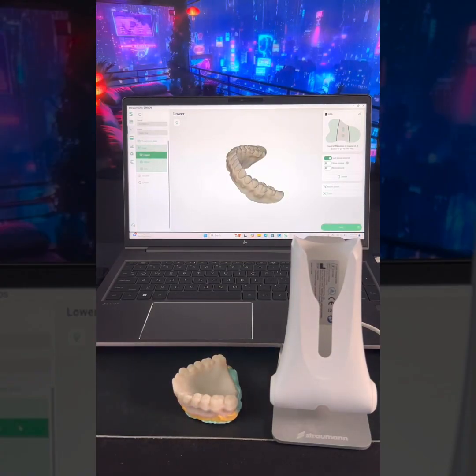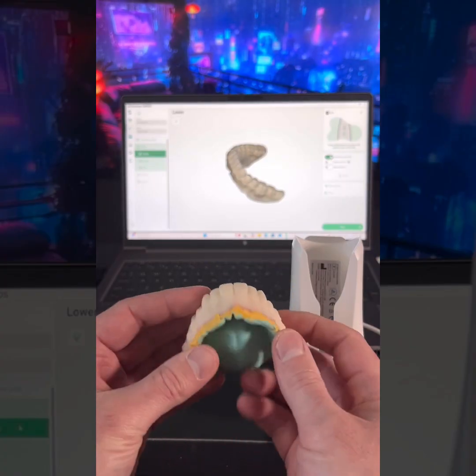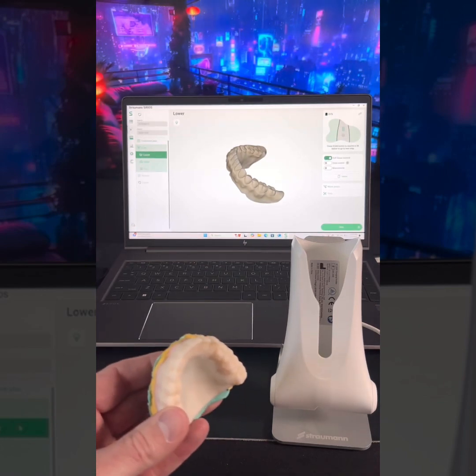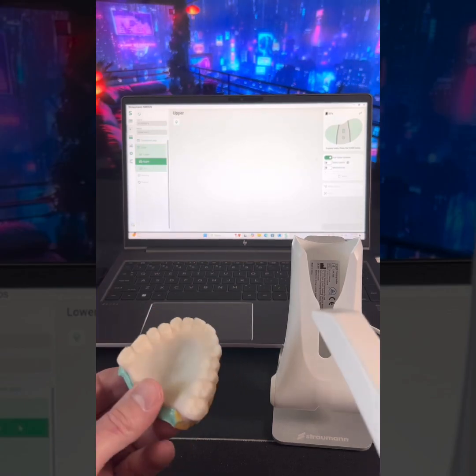Now on to the hard part. Let's see if I can do the upper with the reline. So I got a denture here with the upper and a reline in it, and I want to see how well this can scan with the multiple colors. So let's go to upper — and I'll just leave everything that was on before on the same way. Here we go.